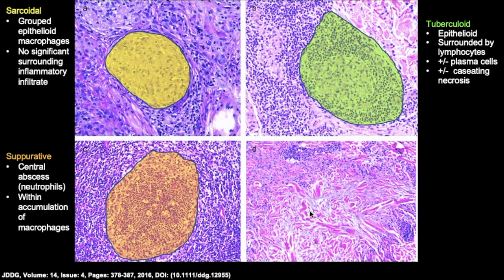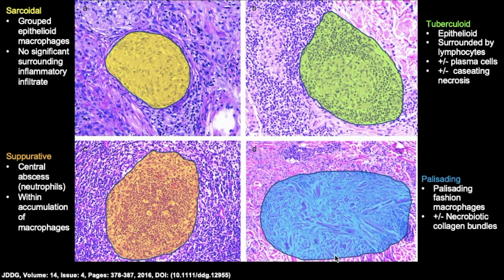All these collagen bundles are undergoing necrosis, and they usually form a well circumscribed area, with not many lymphocytes or inflammation around it. And usually we see other features like increased mucin or maybe other features. We'll talk about it in specific diagnoses.